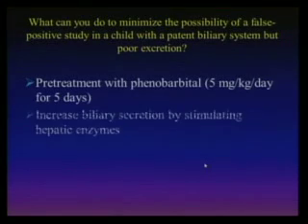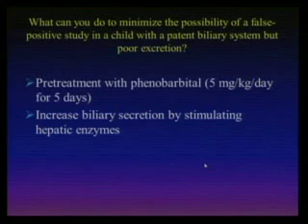Oh, okay, gotcha. So you tell them it's better to do pre-treatment with phenobarbital 5 days prior to the study. If they don't do this, sometimes they don't want to, but that's fine. It depends on them. This is our recommendation. If they have lower suspicion, probably okay. If you do this without activity in the bowel, it's done. But if they have high suspicion and we do not see activity within the bowel at 24 hours, then we have to say, okay, you did not do pre-treatment, and we are not sure because maybe the liver function is not mature, and you better go back and do that again. We had a case like that, and they went back to do pre-treatment, came back to redo the study, and then finally we saw the activity within the bowel.